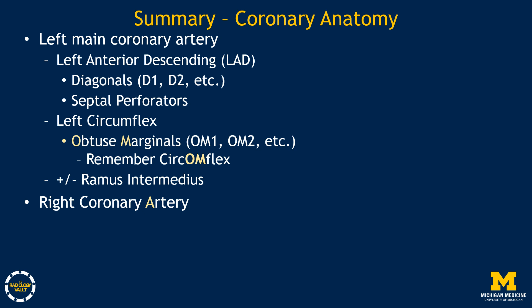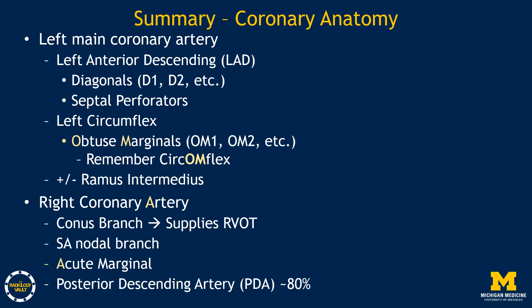The right coronary artery typically gives off a first branch called the conus branch, which supplies the right ventricular outflow tract. The SA nodal branch is identified by its posterior course toward the interatrial septum. The RCA also gives off acute marginal branches — remember: A for RCA/acute marginal versus OM for circumflex. In right dominant individuals, approximately 80% of the time, the RCA terminates as the posterior descending artery. Otherwise, patients may have left dominant circulation supplied by the left circumflex, or co-dominant circulation supplied by both.